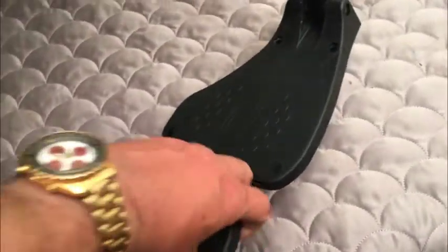Nice foot pedals in the front, which of course fold up as they should, and of course they're removable to put in your vehicle.